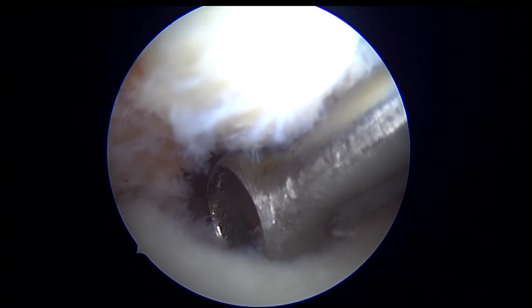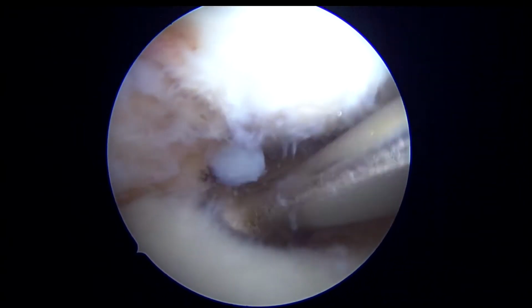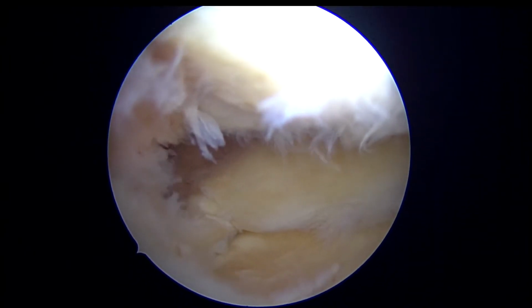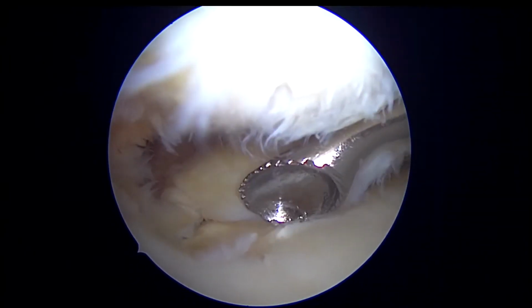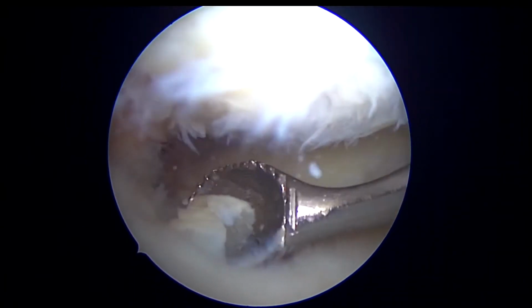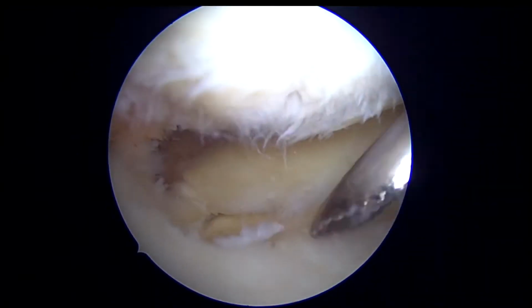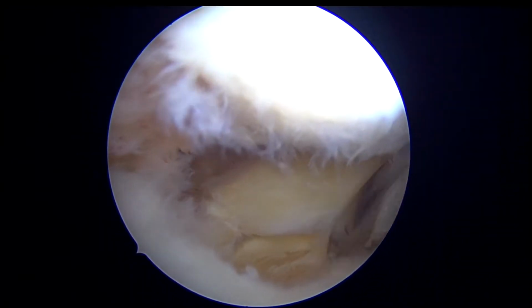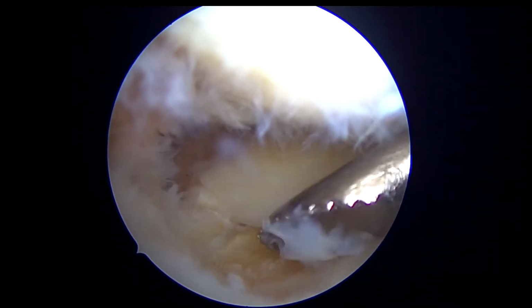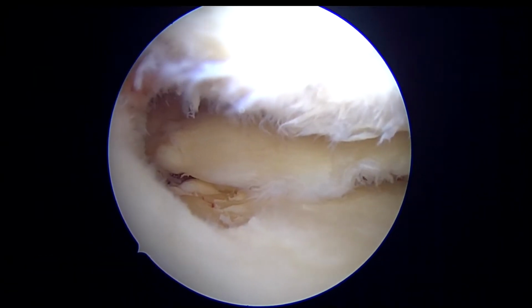So we need to slowly, gently remove the cartilage and prepare the trough. So here we are removing a sliver of the bone to make place for the proper healing of the meniscus root to the bone there.